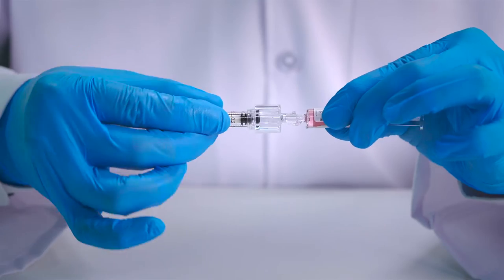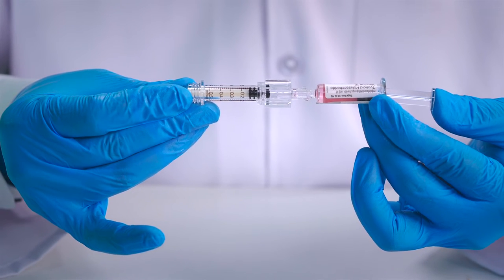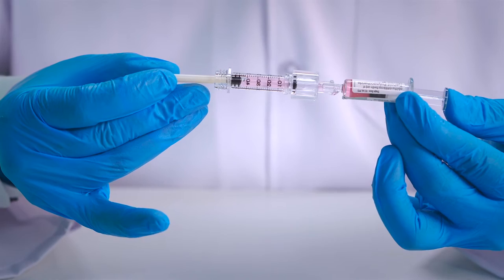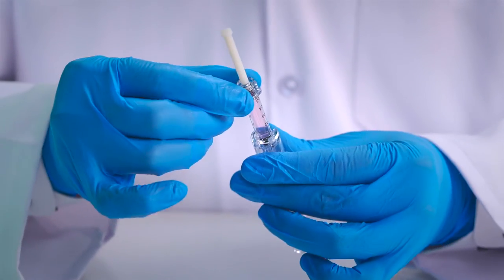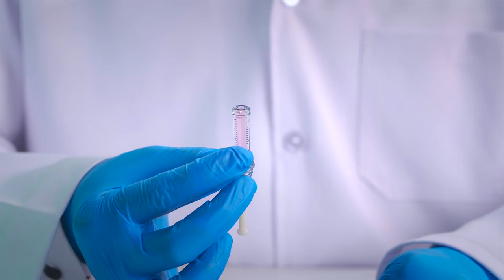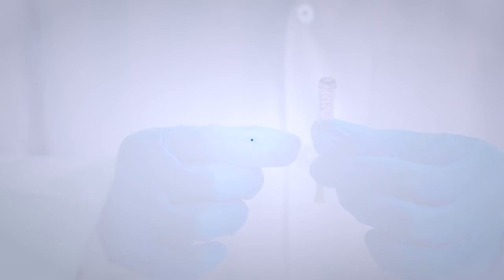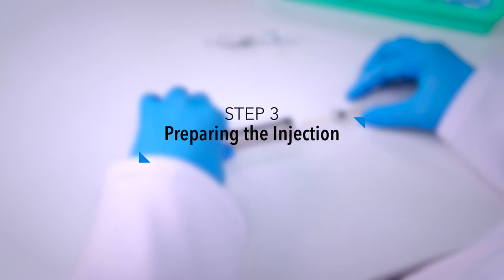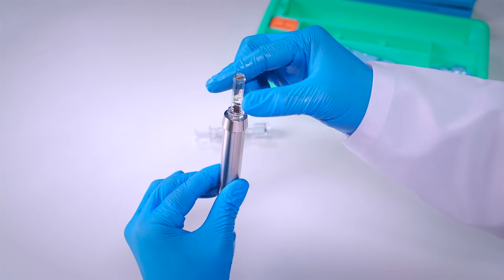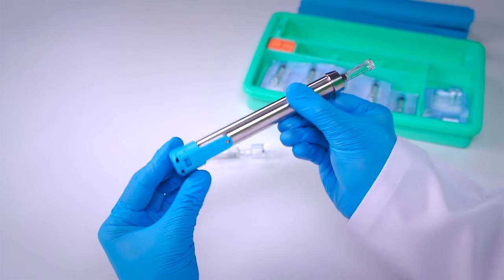Attach the cartridge tip on the other end of the adapter by turning clockwise until secure. Push the plunger of the medicinal pre-filled syringe to transfer the entire medicine into the cartridge. Remove the filled cartridge by rotating counter clockwise. Ensure no air bubbles are present by tapping the cartridge. Insert the filled cartridge plunger down into the loaded NFIS device and turn it clockwise until secure. The system is now ready to use.